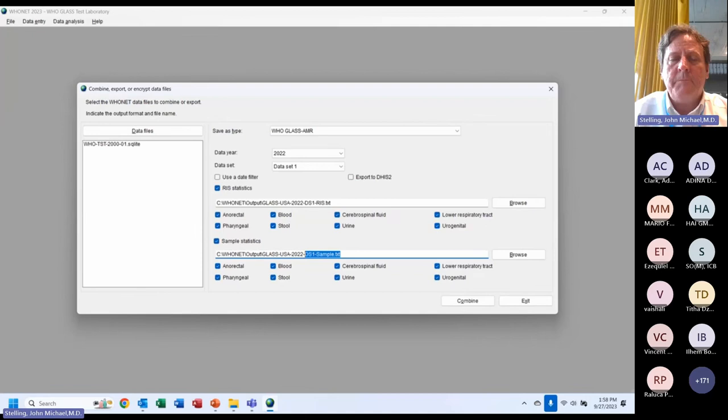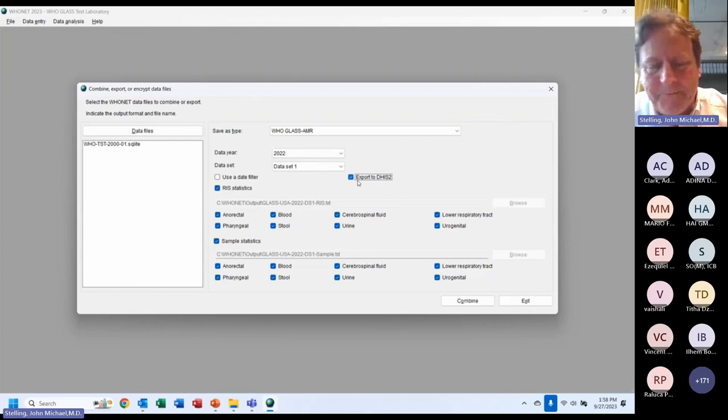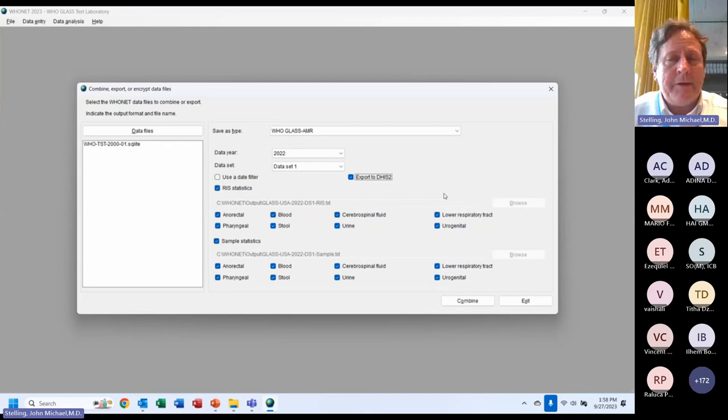Before exiting, there is also an 'Export to DHIS2' option here, but this is not the WHO GLASS DHIS2. We made our own WHO Net DHIS2 module before the WHO DHIS2 platform was created. We may rename this to avoid confusion. If some of you have an interest in the WHO Net AMR DHIS2 module, we're happy to discuss that further, and we think we will have a webinar on it.